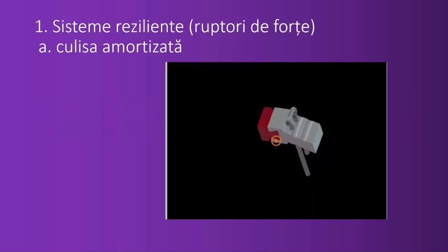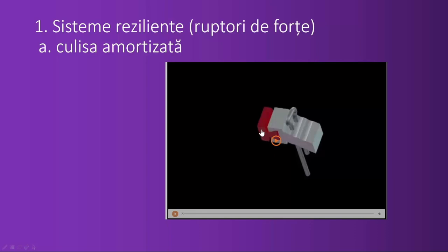You see, this is the coulisse, the vertical system. The red part is the part that will be fixed to the wax pattern that will go on the abutment teeth. Of course, after the casting, that red plastic part will become metal, and the other part will slide along this extracoronary vertical system, or coulisse.